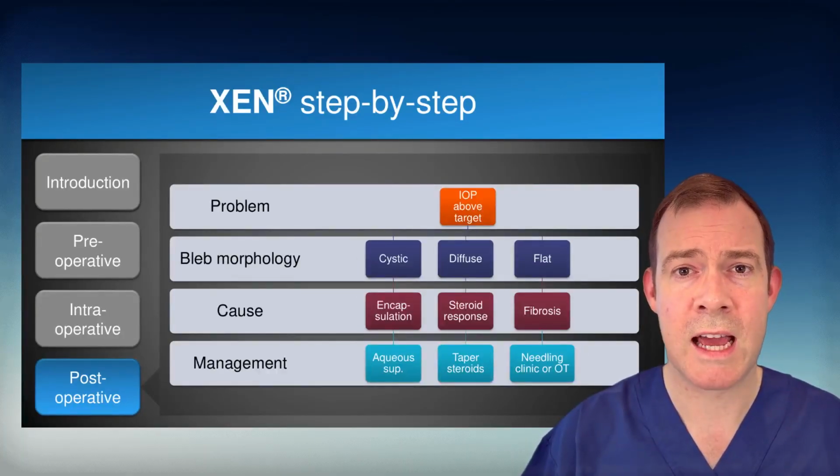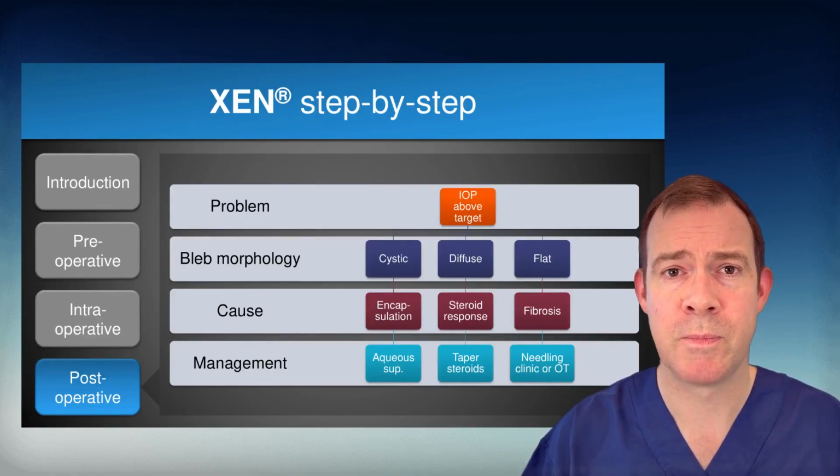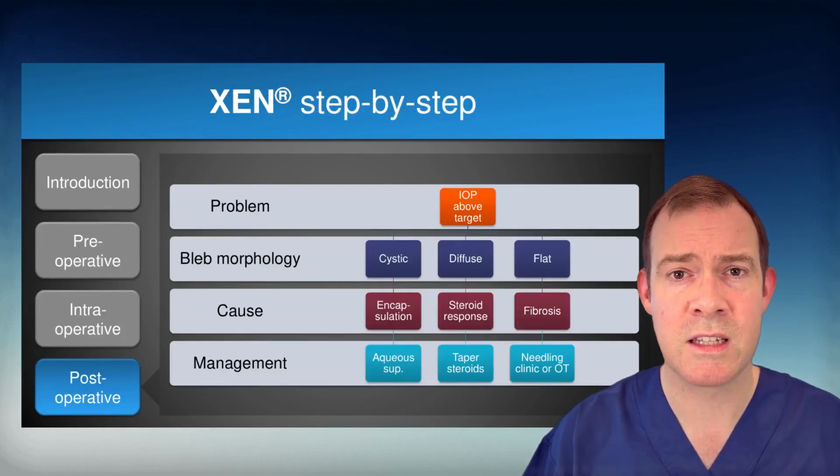If the pressure is above target, we want to look at the bleb morphology to help us identify the cause and the appropriate management. If the pressure is high and the bleb is cystic, it's likely encapsulation. This can be treated initially with aqueous suppressants, which may lower the pressure within the bleb and lead to some remodeling. And if this is unsuccessful, then needling at the slit lamp or in theatre can be performed.